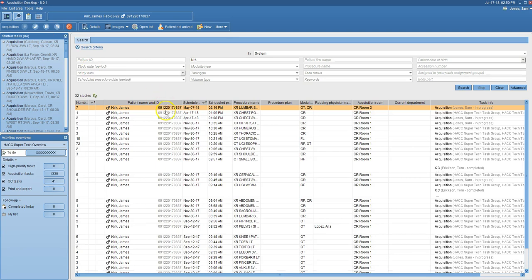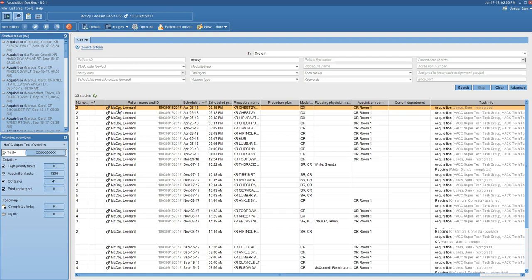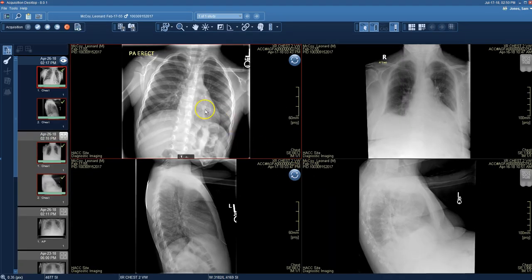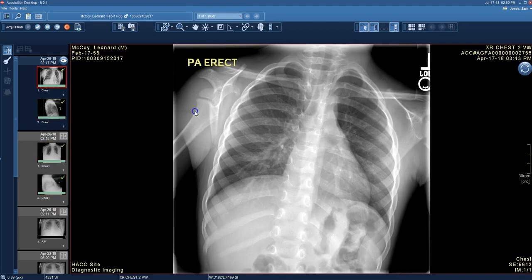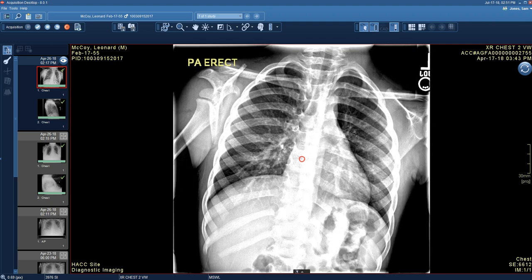Let's go back to search and look at McCoy. I'll type McCoy, click search, and here is Leonard McCoy and all the studies he's had. I'll highlight his chest x-ray row, click on Images, say no to saving the previous patient's work, double-click the chest x-ray, and there is Leonard McCoy's chest x-ray. I can window level it — right-clicking to make it more gray brings out the bones, so I can see the ribs really well, but the lungs look junky and hard to see.